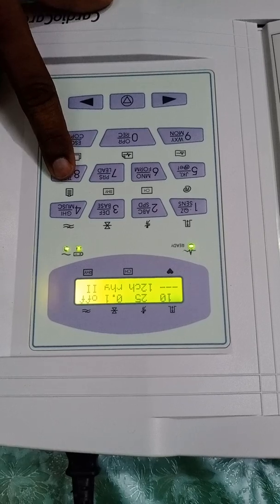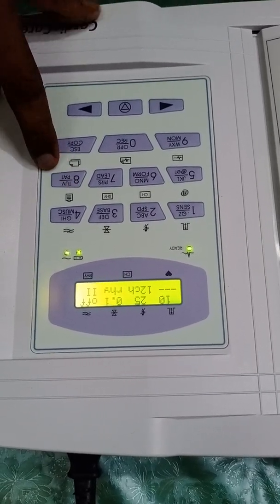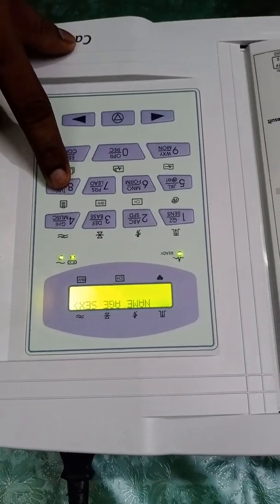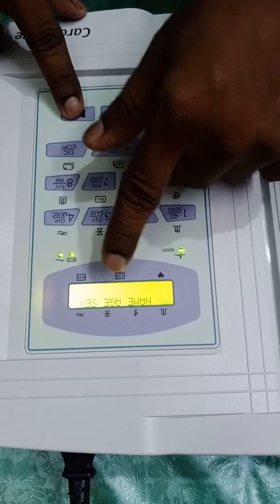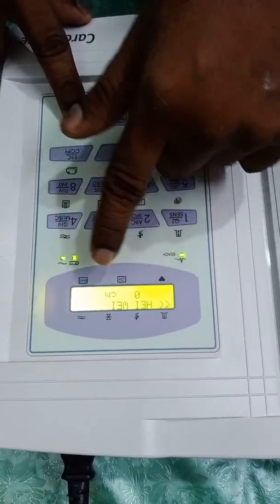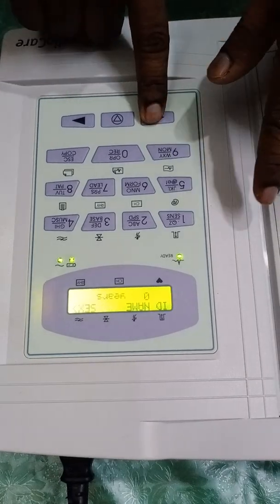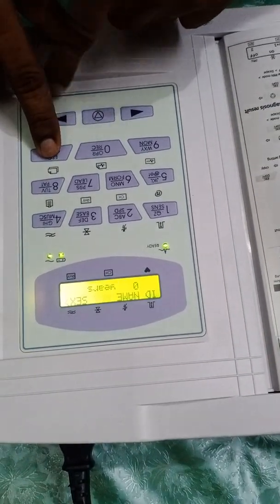The eighth option is the patient data entry. When you want printed details of the patient, you can use this button. You can see it prompts for name, ID, age, sex, height, and weight. The escape button is used to navigate to the next option.